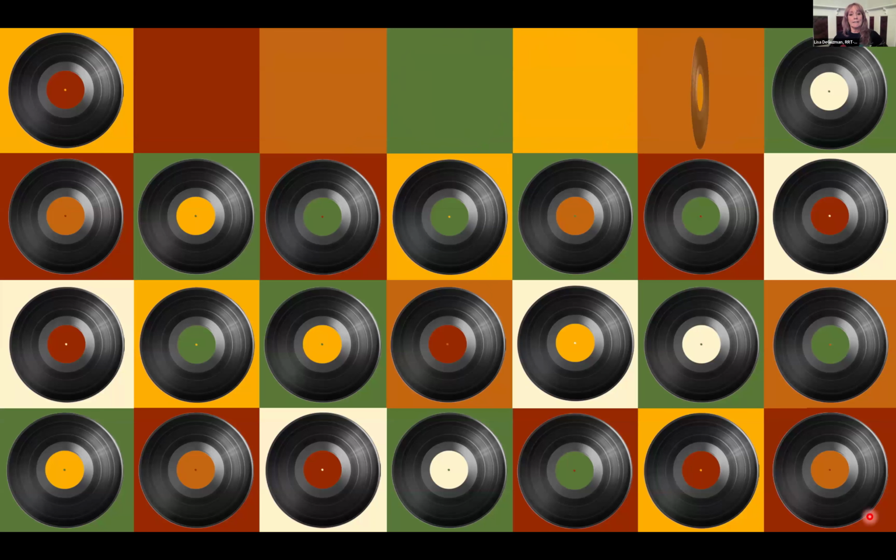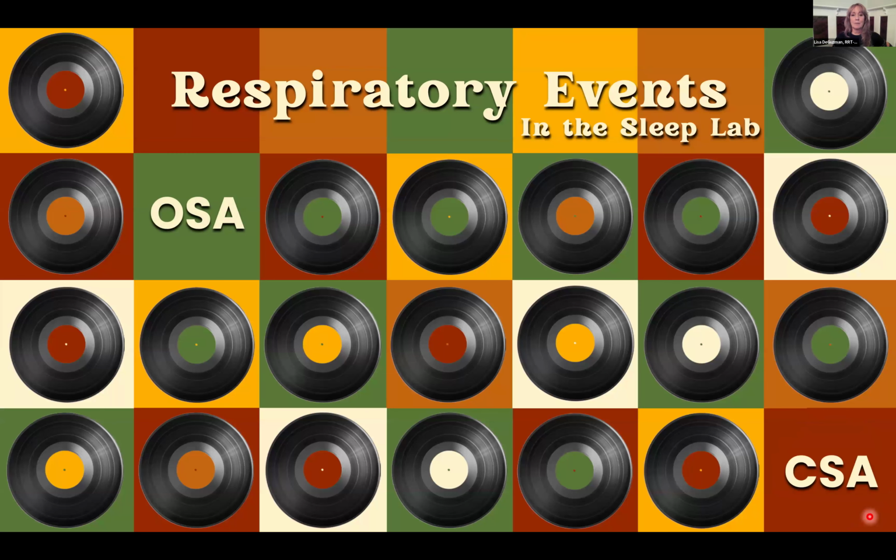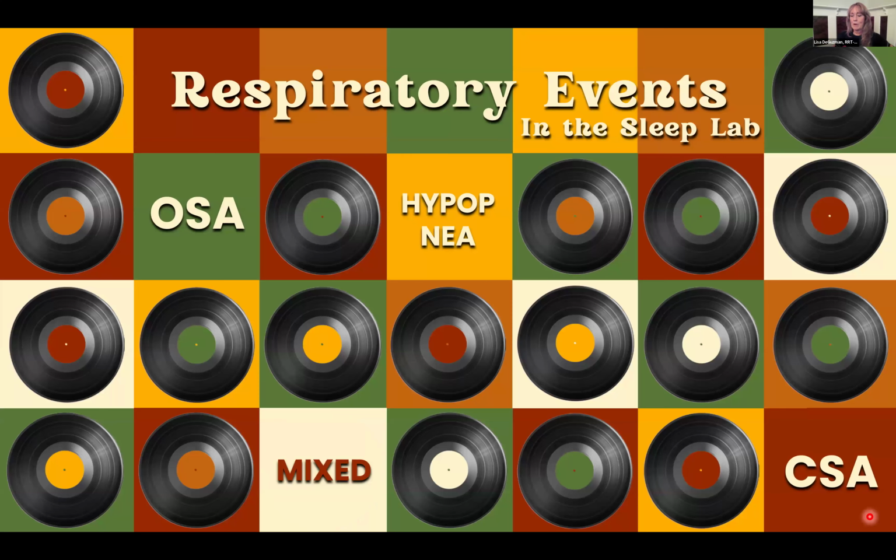We are going to look at respiratory events in the sleep lab. So we're looking for OSA, obstructive sleep apnea, our most common. We're looking for central sleep apnea in the sleep lab. We're looking for hypopnea in the sleep lab, and that's partial airway obstruction. We're looking at mixed apnea. So those have both a central and an obstructive event, or part to it in the event. And then we have RERAs.